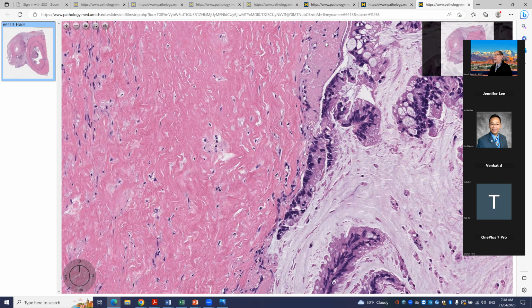So, question. Yeah, question about our potential contaminant of macrophages picking up keratin proteins. And yes, a CD68 or CD163 would help to identify the macrophages, staining simultaneously with both those markers, and that could alleviate that issue.